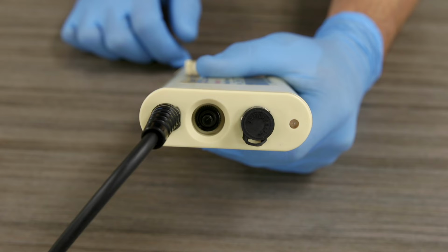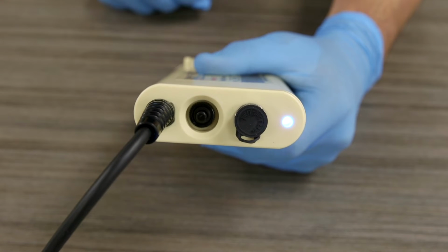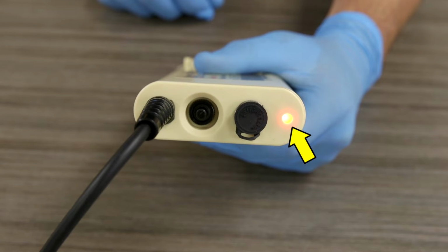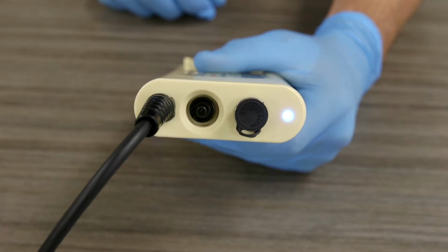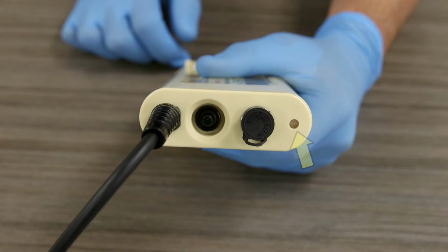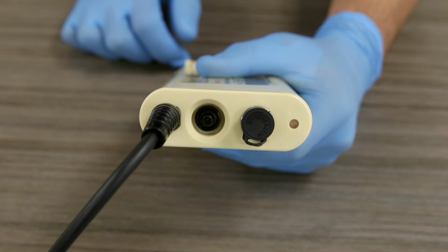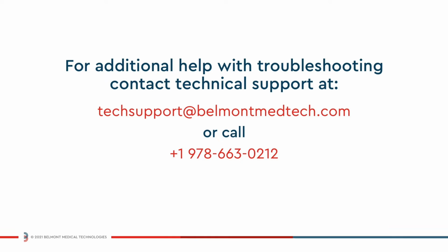Now you are ready to power on the unit. Depress the on-off switch on the battery housing to supply power to the heater unit. Correct operation is confirmed by continuous illumination of the blue LED after a brief flash of the red LED. Warming will initiate within seconds after the device is powered on. If the blue LED does not illuminate, make sure that the battery is charged. After confirming that the battery is charged and the LED still does not illuminate, please contact customer service for assistance.